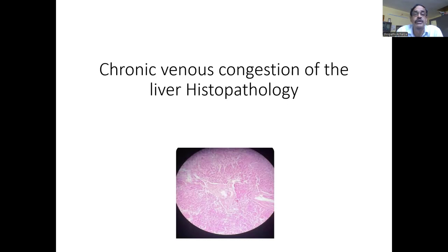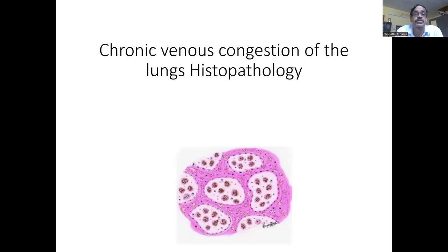Chronic venous congestion of the liver. Next, chronic venous congestion of the lungs.